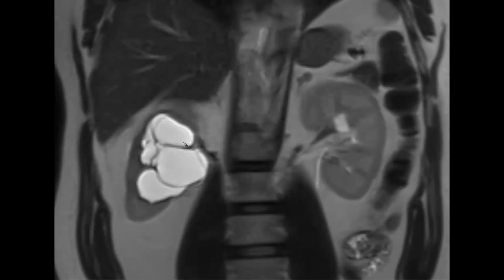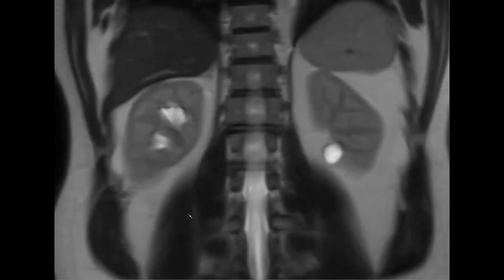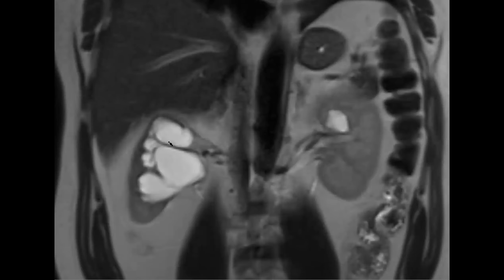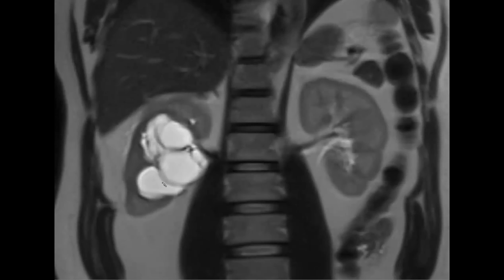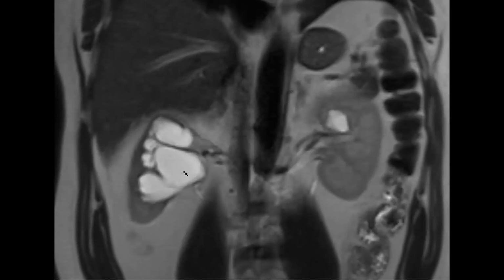MEST tumors are mixed epithelial stromal tumors. They tend to be more solid with cystic components. I think there may be some overlap between them, but interestingly, this one turned out to be a MEST tumor. We said it could be an MCN, could be a cystic RCC, not sure. They removed it and it was a MEST, which is also a benign tumor. Both of them have a significant female predominance. MEST tumors are actually 10-to-1 female to male, and also tend to be middle-aged.